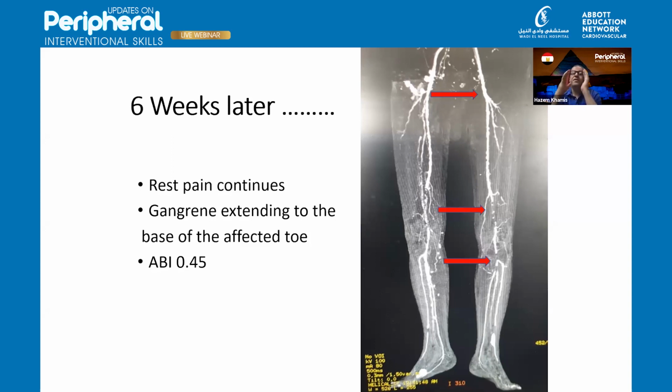Alberto, is there any place for rotablation at this moment, if the conventional balloon failed to do the job satisfactorily, from the recoil, from the residual stenosis? Do we need to debulk this lesion with rotablation, or use rotablation from the start before the balloon dilatation? I tell you, look at the final result of the first procedure. I would be scared to do something in this important dissection, where also we have a lot of calcification in the vessel wall.